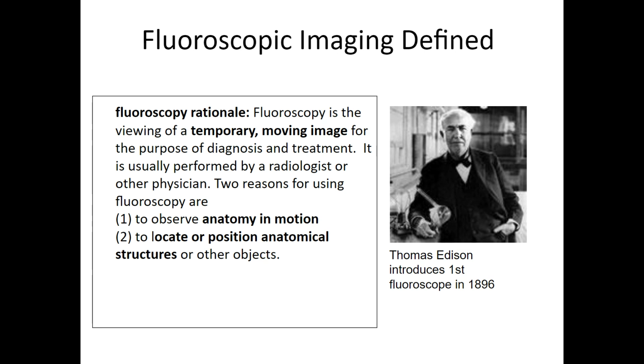And fluoro is being used all over the place. It's being used, although I don't touch on it much, with the C-arm in the OR. And it's being used, as mentioned, for GI kind of work, but also there's a whole huge department based on cardiac catheterization and on special procedures that you might find yourself in one day. Next year, not as first-year students, you get a rotation through the special procedures angiographic departments to see what's going on in there. So they're heavy users of fluoro, right?